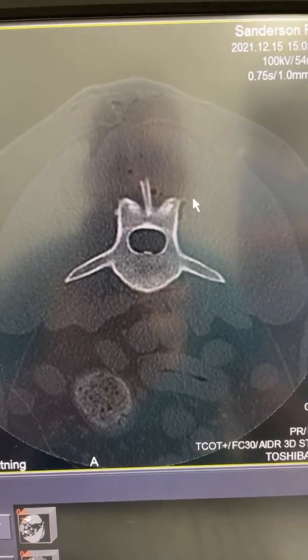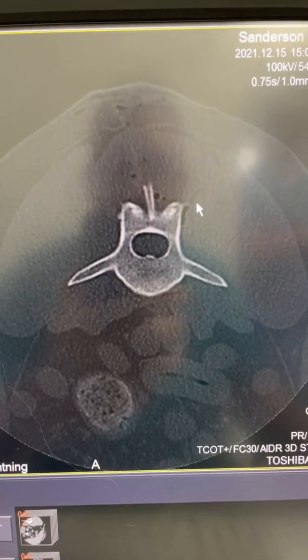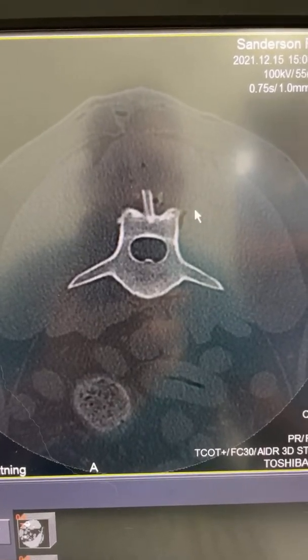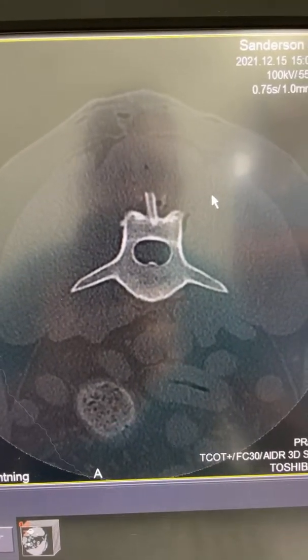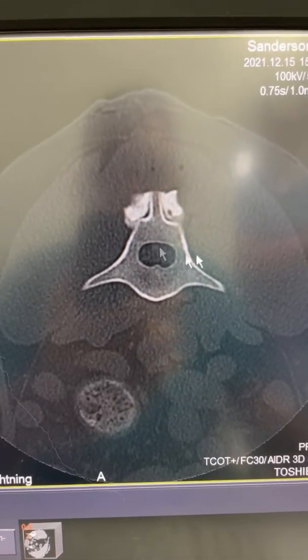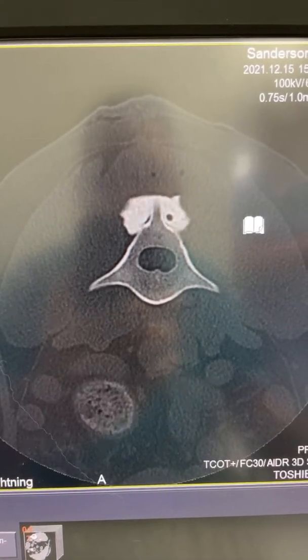I'm just going to quickly review the CT scan after the lumbosacral distraction fusion that we just did in surgery. Coming through about L5, you can see the bone cement around the dorsal spinous process of L5.